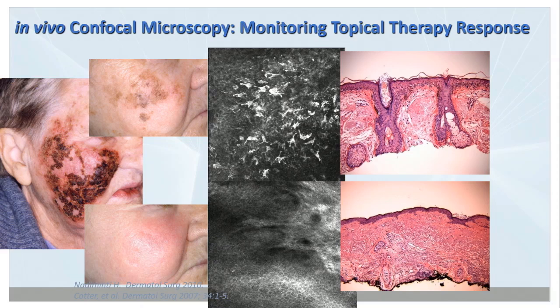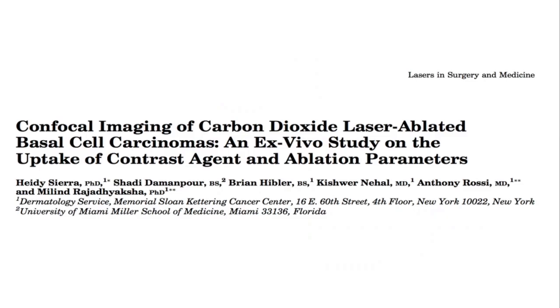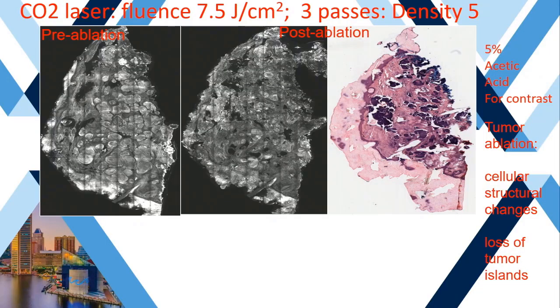And then afterwards, after imiquimod, not only do you have clinical resolution and the skin looks beautiful, but under confocal, there's the resolution of the honeycomb pattern of the epidermis, as well as the absence of any of these atypical lesions. And this is even post-radiotherapy, so radiation therapy, which is becoming more popular for early skin cancers. And I'm even doing this with laser ablation of skin cancers. So this is ex vivo pre-ablation and post-ablation, and then the histology that's corresponding.